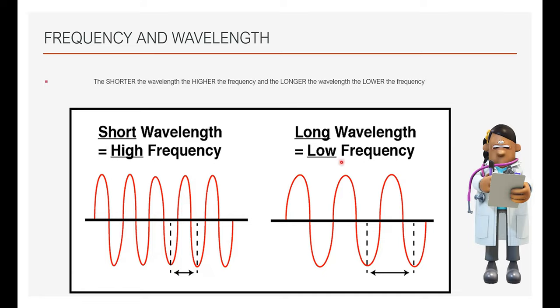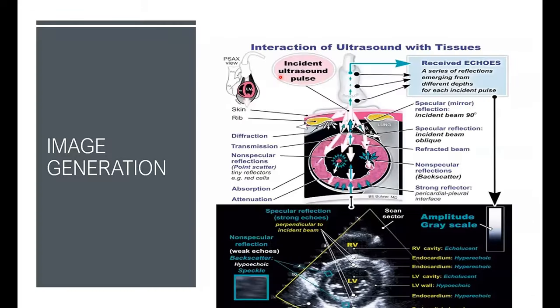Whereas with a low frequency probe, you're generating fewer sound waves, which have less attenuation, so they can travel a longer distance. And this brings us to the concept that when we use high frequencies, we tend to be able to see the superficial structures much better. Hence the concept of using high frequency in lung ultrasound, especially for extremely preterm and preterm babies, because you really want to focus at the level of the pleural line and superficial structures as opposed to the deeper structures. But if you're looking for deep consolidations, that might need a little bit of fiddling around.